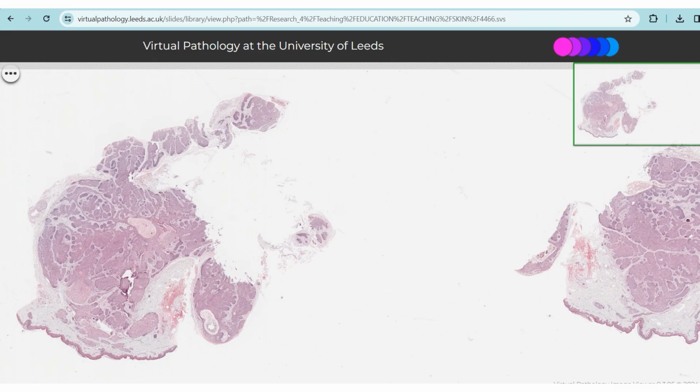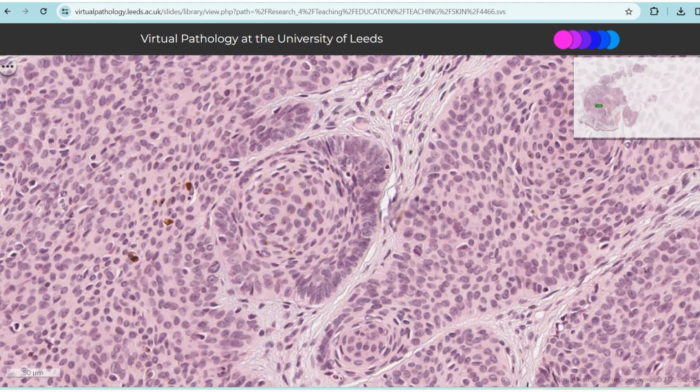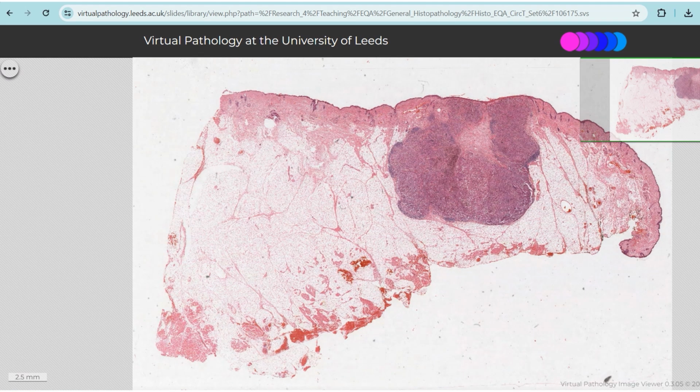Next is the tumor inside the skin, basal cell carcinoma. So this is the skin. This is the dermis. You can see there's a tumor there. It forms nodules. Okay. In low power, this is the only malignancy that does not have all the features of malignancy, because it is monomorphic, it is not hyperchromatic, and doesn't have any increase in NC ratio. The only difference is the architectural derangement, and you can see at each nodule the cells appear to be stacking on each other. This is what we call peripheral palisading, and in between the nodules you can also see clefts.